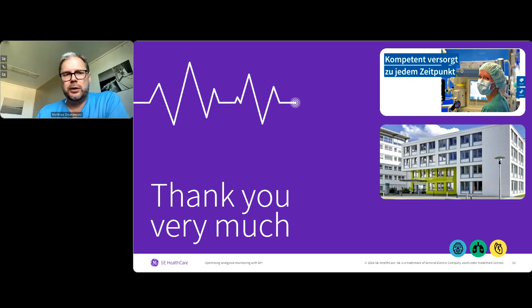So the surgeon tells you that he's now going back and thus begins with the suture. We did allow during this phase values higher than 60. So our goal was entropy values between 60, 65, and 70, which was sufficient. No patient in our study had any recall of the emergence phase. I hope that helps answering the question.